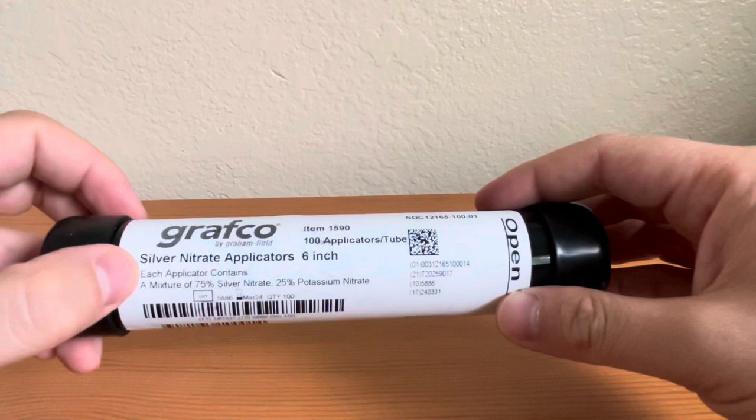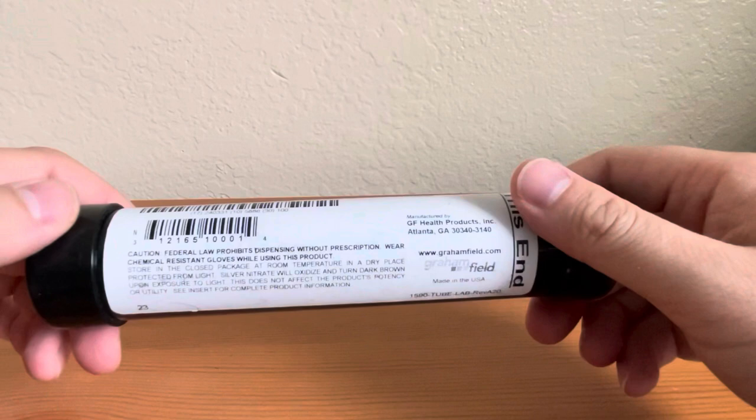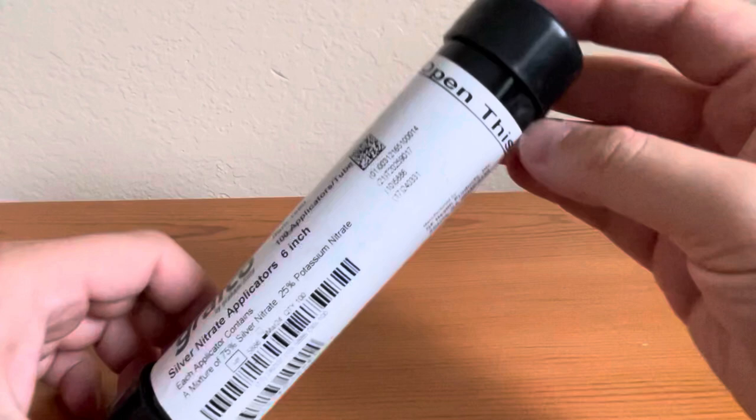Silver nitrate applicator sticks. Each silver nitrate stick contains 75% silver nitrate and 25% potassium nitrate. Indications for use include cauterization of skin or mucous membranes and for removing warts and granulated tissues.